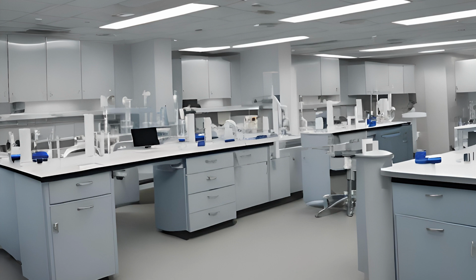Most of the time, patients go limp. If that happens, it is now on you to make sure that that person does not fall out of the chair or hit their head on the way down. If they're so big that you can't hold them in the chair, let's say you're 120 pounds, your patient's 400 pounds, good luck holding that person up. You will then, as gently as you can, guide them down so that they don't hit their head on anything and injure themselves.